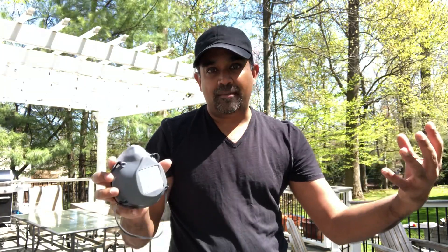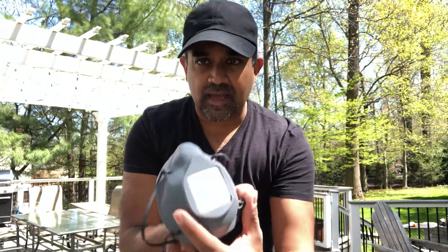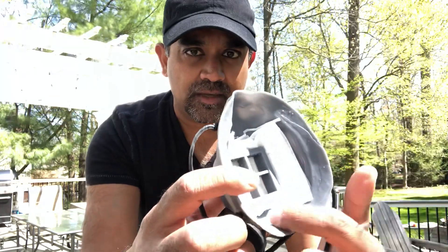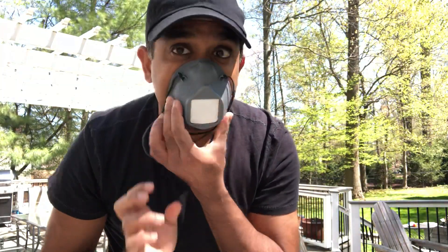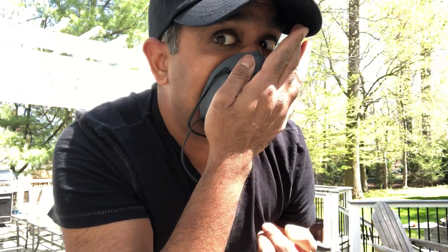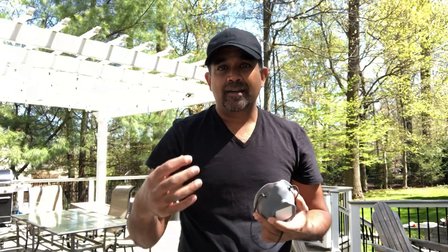In CAD design software, we merge the small, medium, or large Montana mask with this custom face scan. What you get is something that looks like this — this area has been custom fit to my face. So when I put this on, it fits really well. I can breathe. And if I cover the front, it has a perfect peripheral seal around the edge, so we know nothing is getting past it.